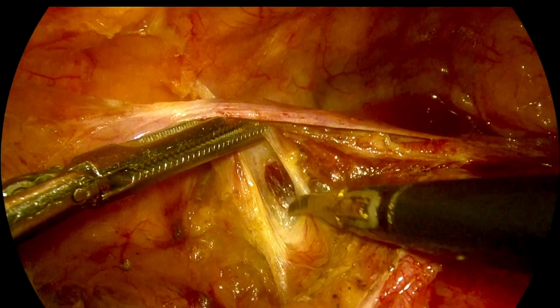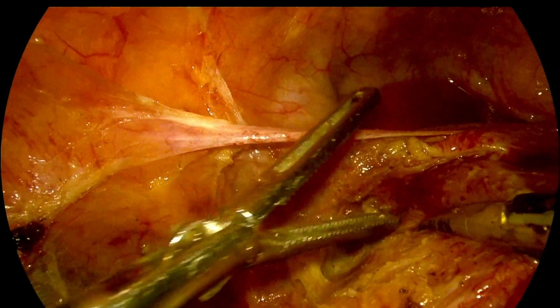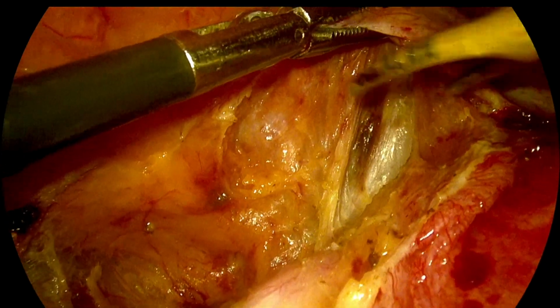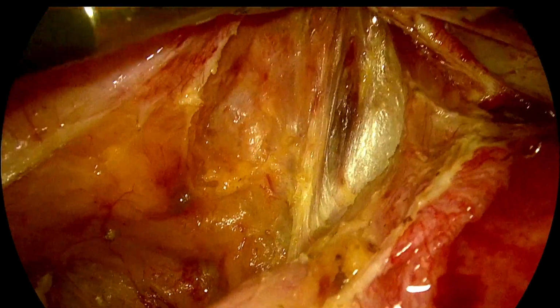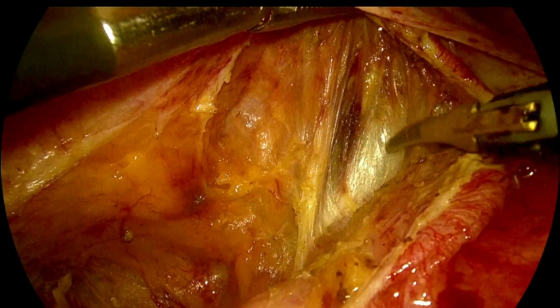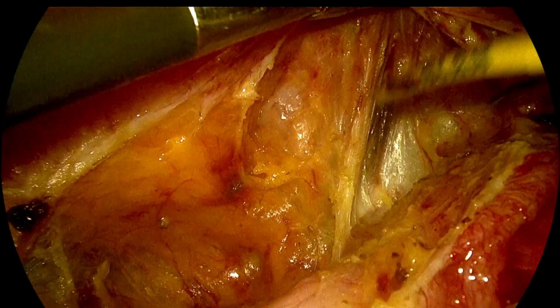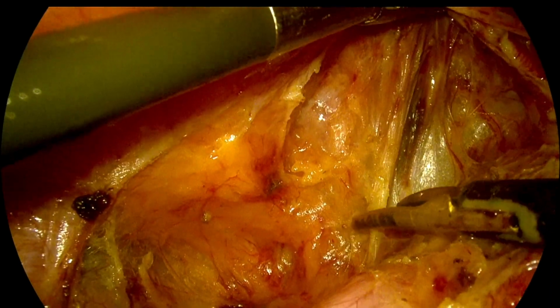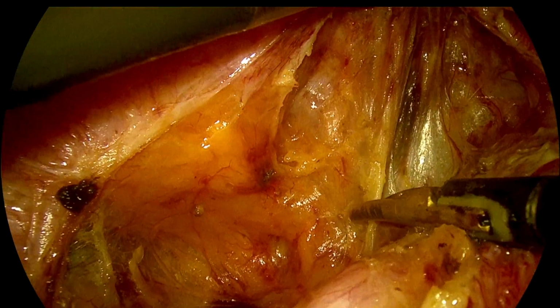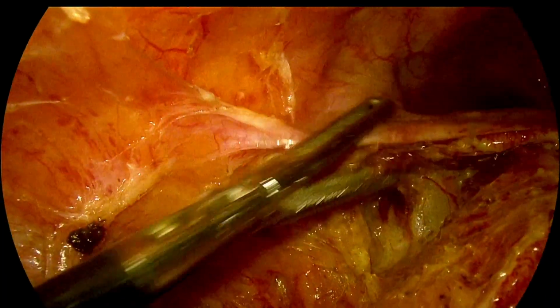You can see, this loose cellular tissue is also fibrotic. It's not giving away very easily. It needs to be divided, and then only can it be separated. So these are all thick bands of tissue that are fibrosed.